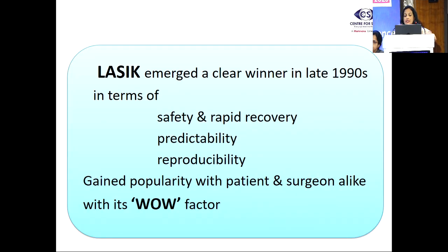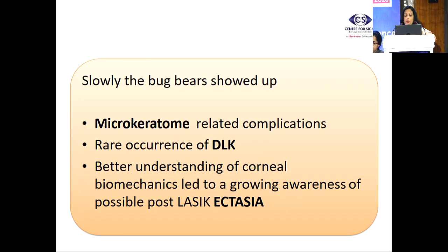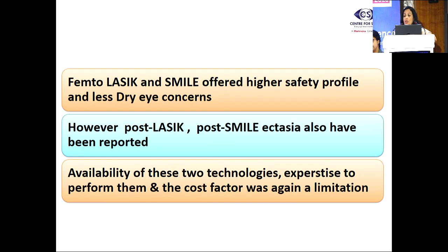In that time, LASIK emerged as a clear winner in the late 1990s in terms of safety, rapid recovery, predictability and reproducibility. Both doctors and patients had the wow factor, and it was a very popular procedure. However, slowly the bugbears started showing up in the form of microkeratome related complications, a rare occurrence of DLK, and a better understanding of corneal wound remodeling and biomechanics. We also became more aware of the possible post-LASIK ectasia.